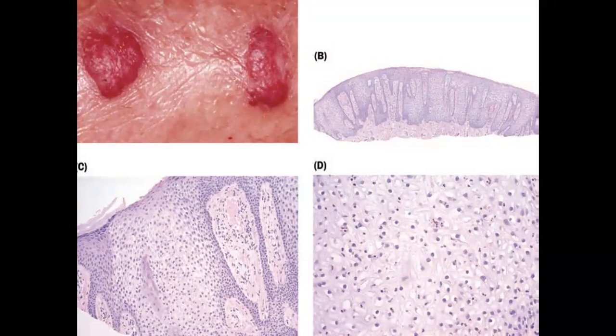These images are of a benign lesion from the epidermis. You can see the clinical appearance, which is of a red papule or a nodule, and the typical feature in the epidermis is the presence of clear cells in the keratinocytes, which are the glycogen-containing cells. These clear cells have sharp boundaries with the normal epidermis, and this is the clear cell acanthoma.